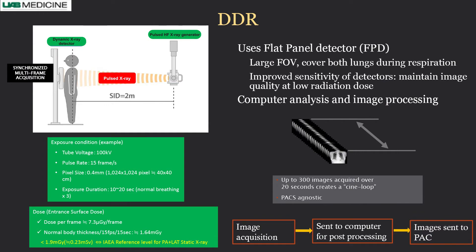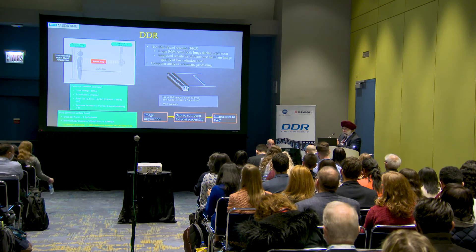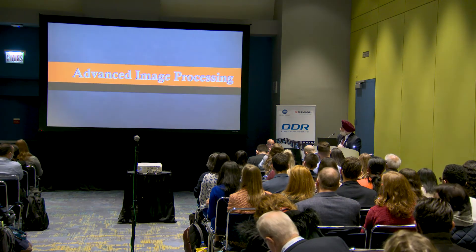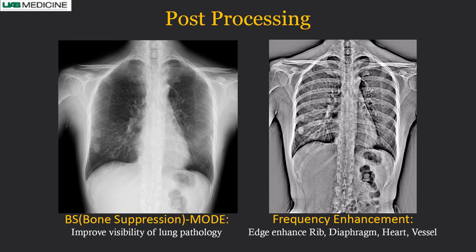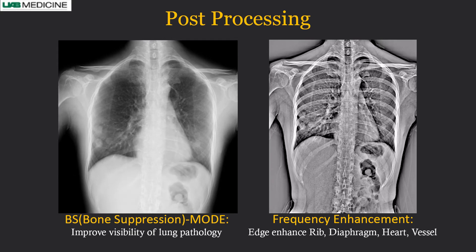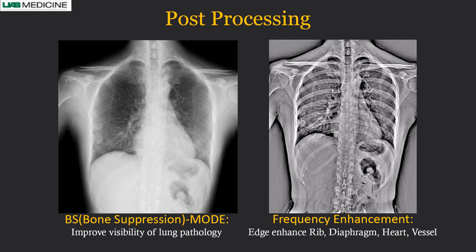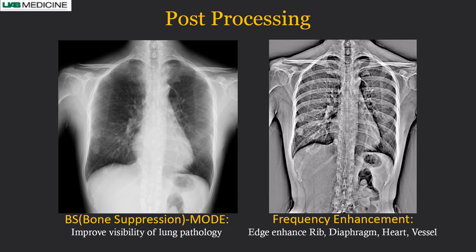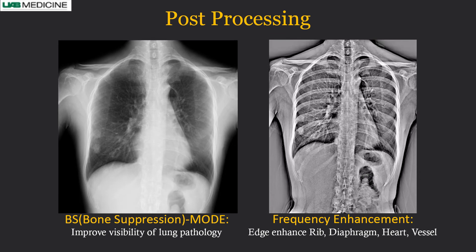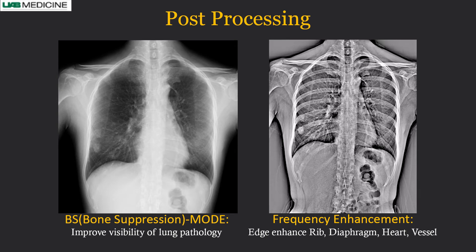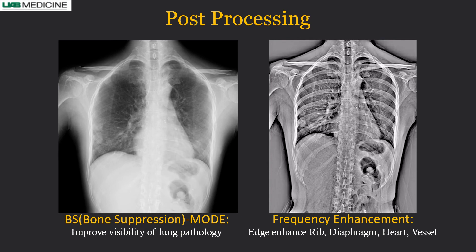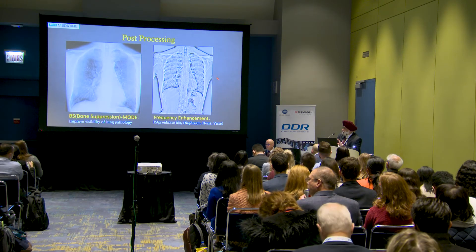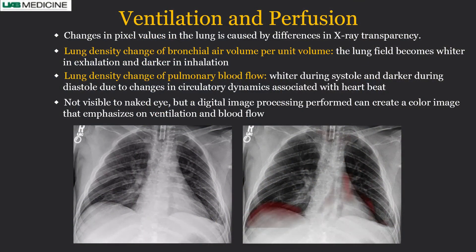Once processing is done, you get all the images: a static PA, a lateral, and the image with motion. There are also post-processed images. Post-processing can involve bone removal — similar to dual-energy radiography — but with movement, so you can look at a nodule in the right lung very clearly. Or you can edge-enhance it, called frequency enhancement, to look at bones and sharp edges around the diaphragm and cardiac silhouette. This is also useful for looking at lines and tubes.